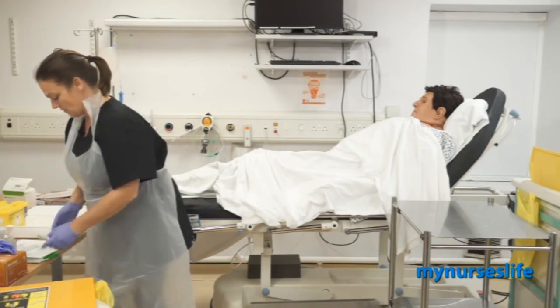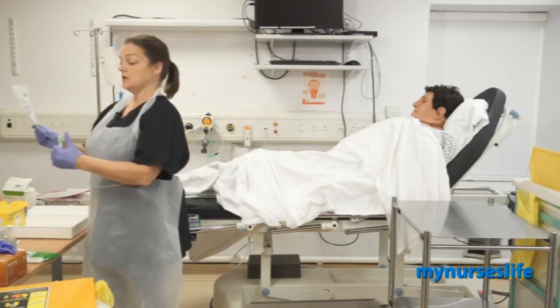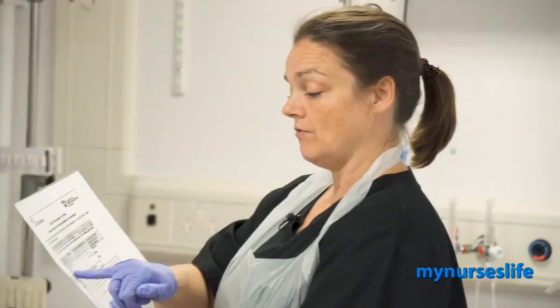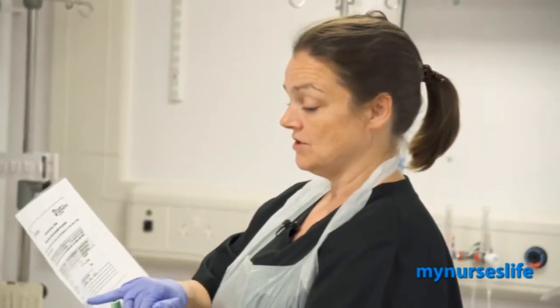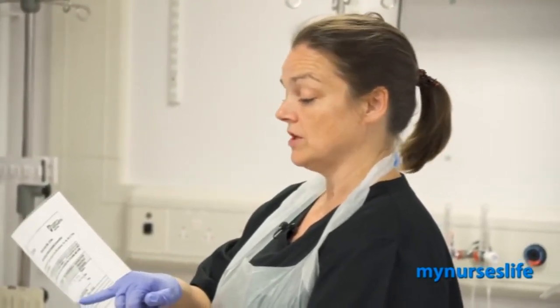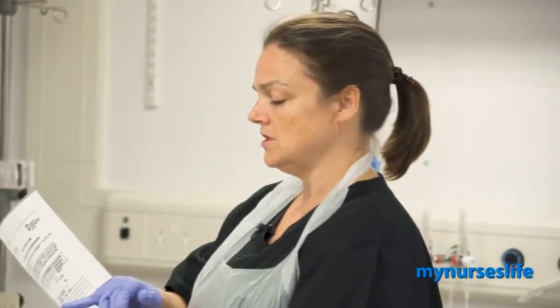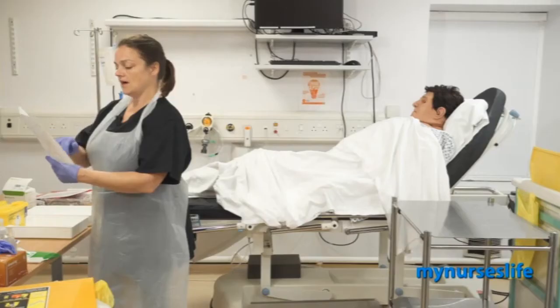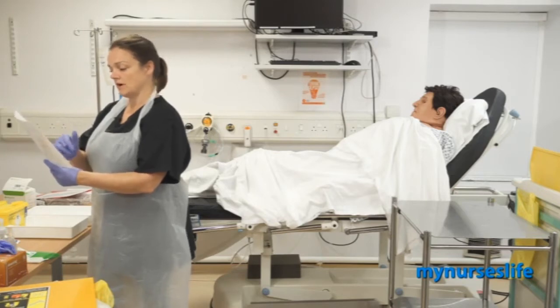Let's have a look. So the prescription, I'm going to check the 6 rights of medication administration. So we've got the right patient, Emma Hargreaves, and we've checked her address and date of birth, which are correct. It's Glargine, which is the right drug. I know I'm coming to give her insulin. 17 units, that's the correct dose. And it's subcutaneous, which is the right route.